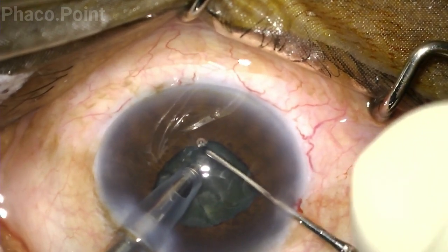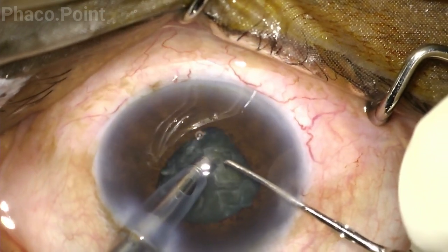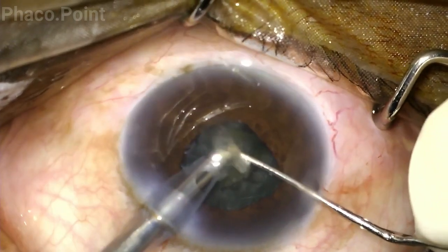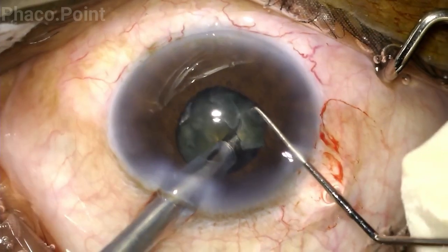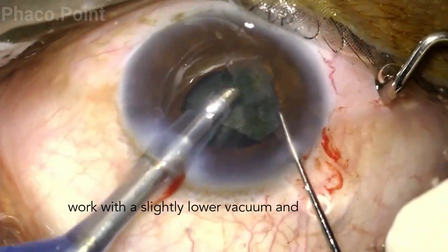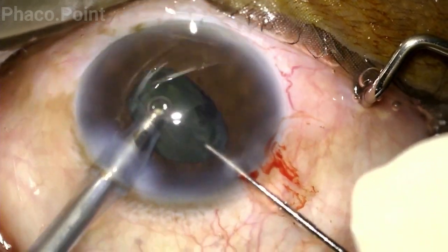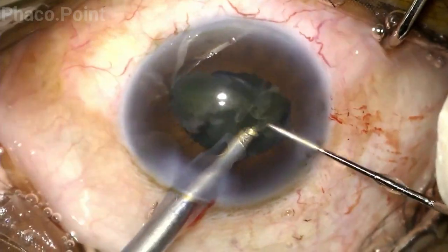When dealing with nuclear emulsification with a small pupil, you have a reduced area of working. The only technique that will work is a direct chop because that ensures whatever you need to do can be done within the central four to five millimeters. Phacoemulsification parameters should include energy just enough to impale and then emulsify the nuclear fragments. Vacuum and flow are maintained at lower levels for more controlled nuclear emulsification. It's wise to keep the probe slightly proximally, as keeping it at or slightly beyond the center might result in accidentally engaging the pupillary edge.